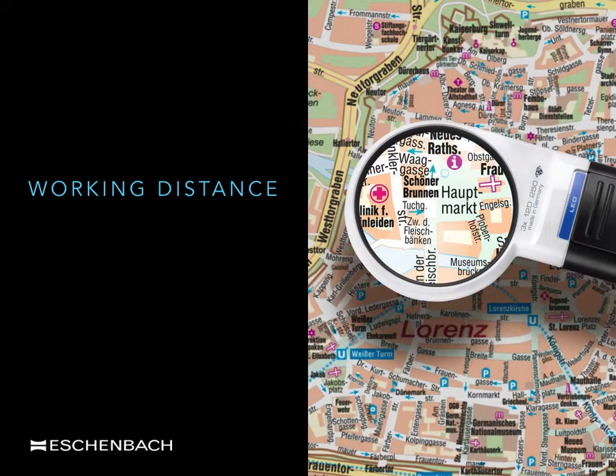Working distance in this context relates to how far off the page the magnifier is held. If a magnifier is placed on the surface of an object — in this case the object is a map — there will be very little magnification. By raising the magnifier gradually off the page, both the working distance and the magnification will increase. There will come a point off the page when the maximum amount of magnification has been achieved, after which the image of the map will go out of focus. The working distance has now gone beyond the range of magnification for that magnifier.